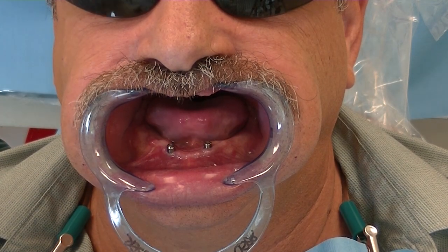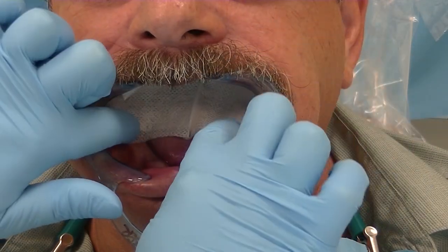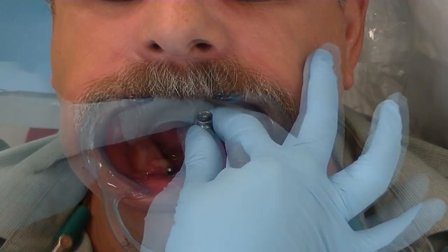Hello, this is Dr. Michael Shearer and this is LearnLocator. What we're going to be doing in this webinar today is a clinical demonstration of the Zest Chair Side Attachment Processing material.